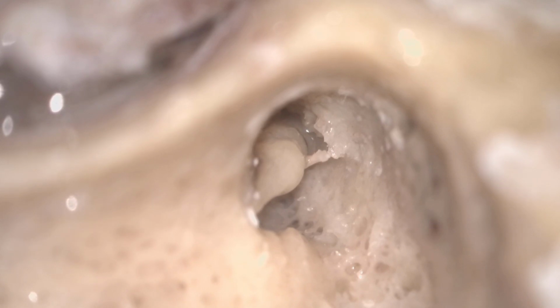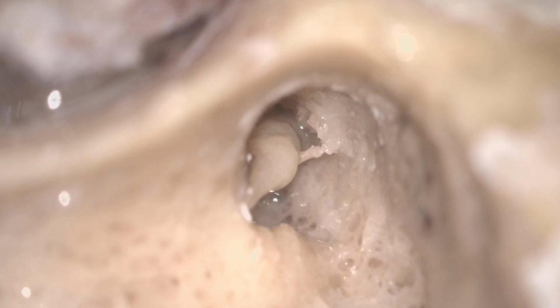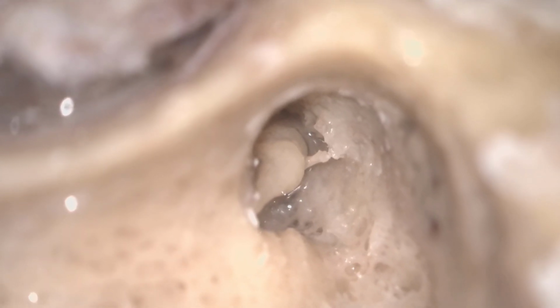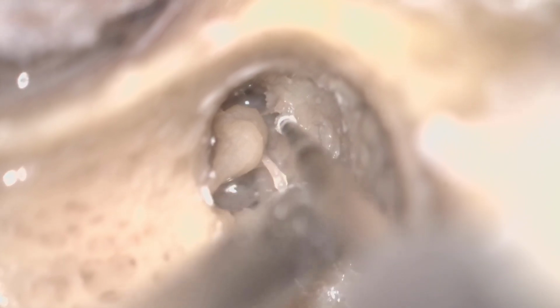And one more thing, the cog is an embryological remnant. When the middle ear and the mastoid develop in the epitympanic part, there is a saccus anticus and saccus medius. When they join in embryological life, the demarcation between the saccus anticus and saccus medius is defined as the bony projection, that is the cog. So this is the embryological remnant. Okay, sir, and look, you can clearly see, this is the cog.